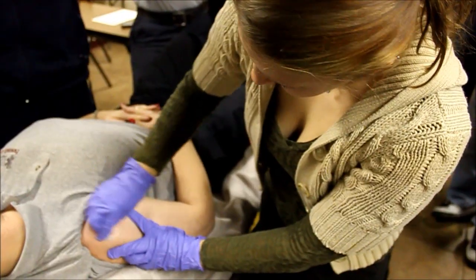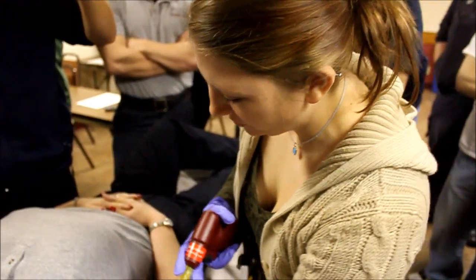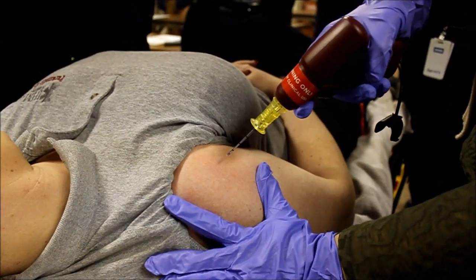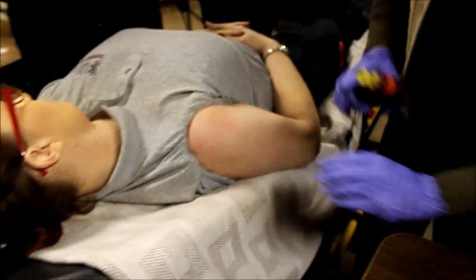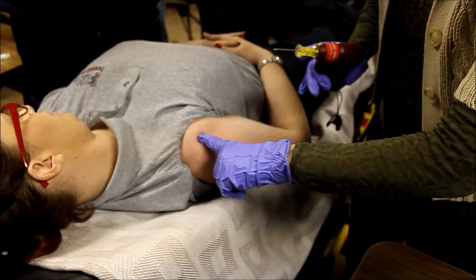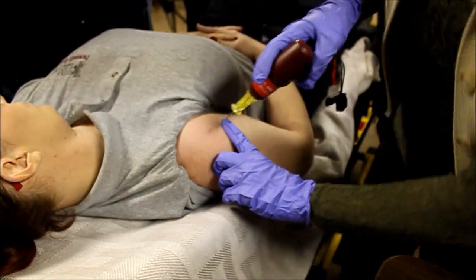No worries, Janie. All the women always volunteer. We've had kids. Don't hold the hub with your fingers — just hold the driver with your index finger over the trigger like a gun. Got your landmark? Go ahead and palpate again. Feel your landmarks again before you start drilling. You can feel it with your left hand. Just remember how you felt the surgical neck. Go through the skin first — should I clean it a third time? You're okay. Go through the skin first and then until you hit bone, then get your bearings and make sure you're perpendicular to the skin.